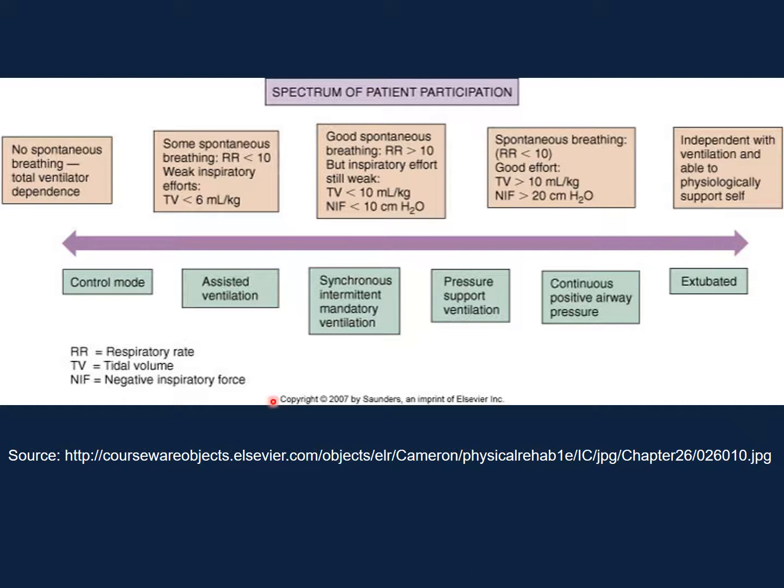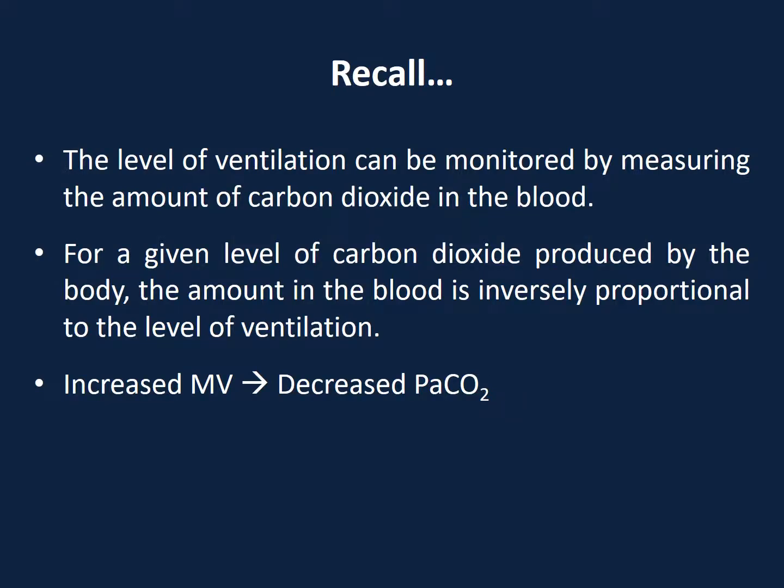So looking at the different modes that the patient is at, you can then determine how the rehabilitation journey or the treatment plan or therapy plan for the patient should look, in terms of how you would like the patient to be more active, in other words. So that's that for mechanical ventilation.